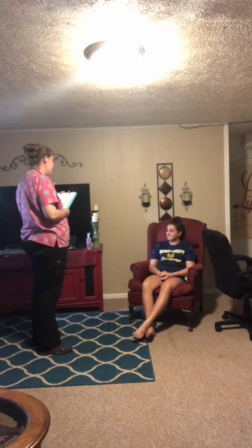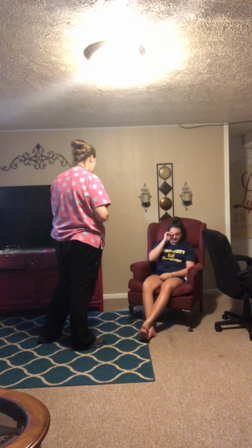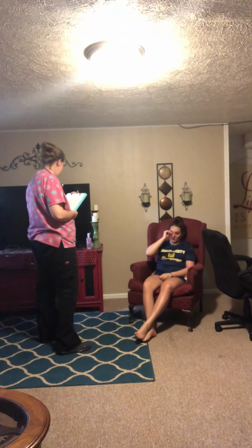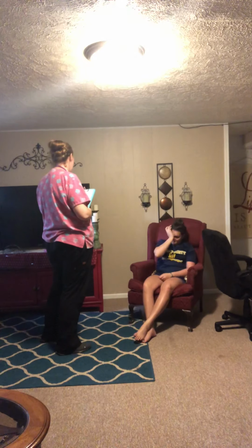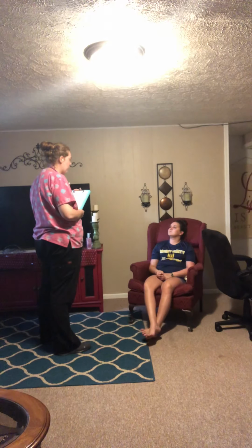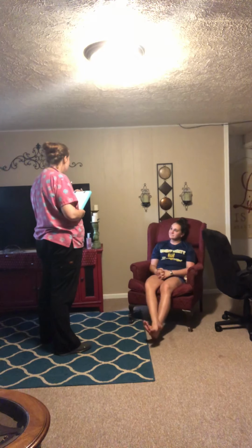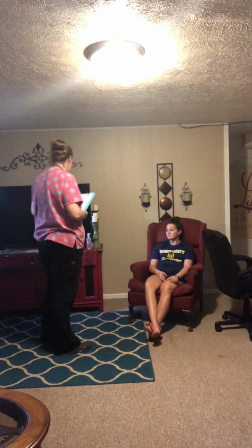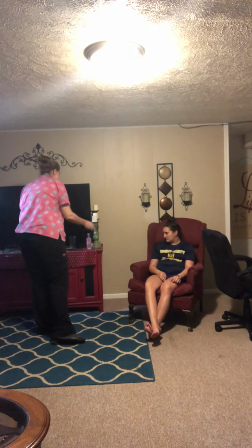All right. Could you verify your name and birth date for me today? Miranda Jean Pribble, 8/24/94. Okay. All right. So I'm going to be helping you with respiratory care treatments today. Is that something you've ever done before? No. In the past? Okay. So I'm going to just go ahead and instruct you on what these medications are for and how to use them, okay? Perfect. All right.